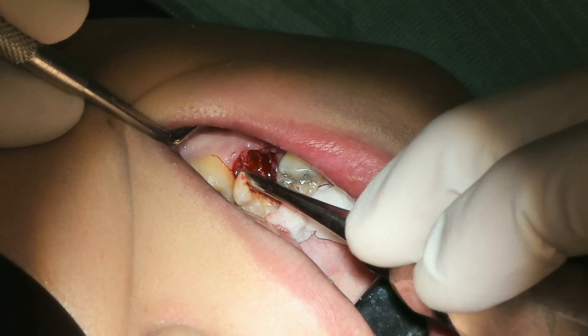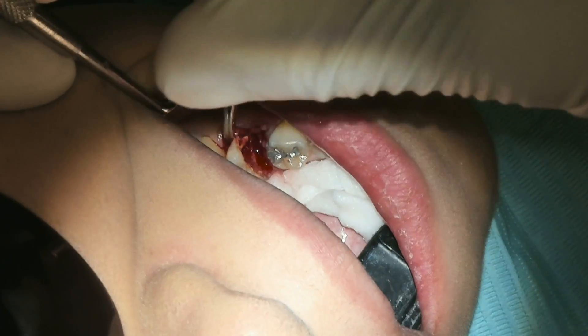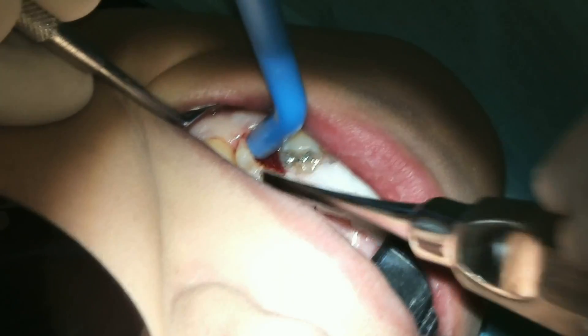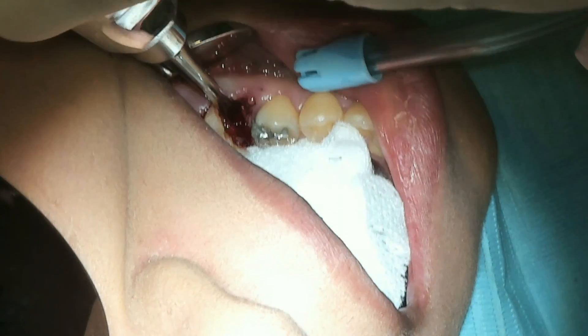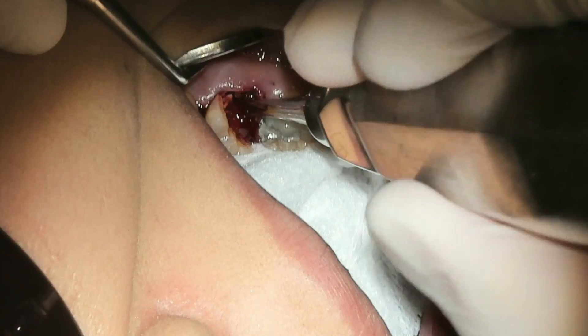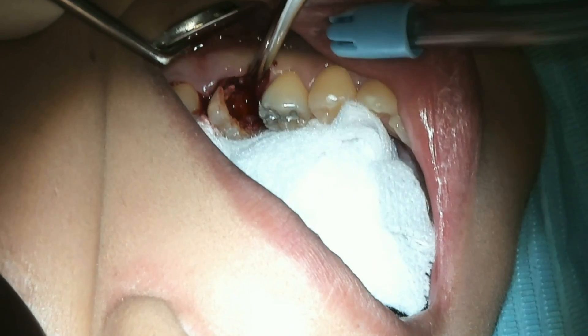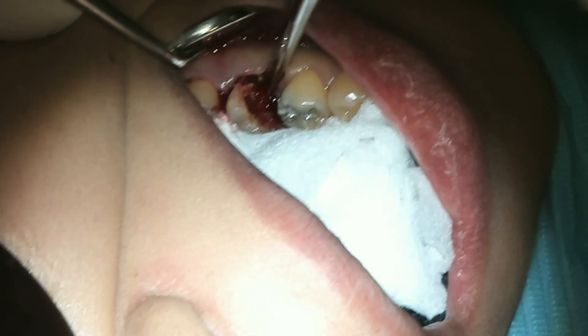Here I start elevating off the distal to remove the distal root. But I notice that the crown section of that tooth is much gummier than I expected at first. So I go ahead and use the elevator to make sure that the mesial and distal roots are separated. Then I start elevating the distal section out, and I'm getting pretty good movement, but for some reason it's hanging up just a little bit.